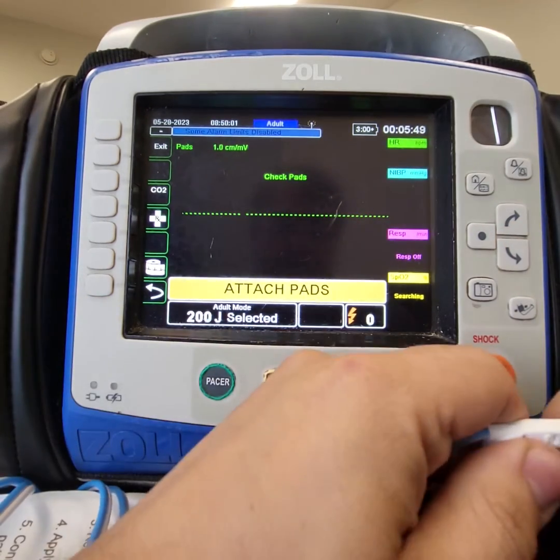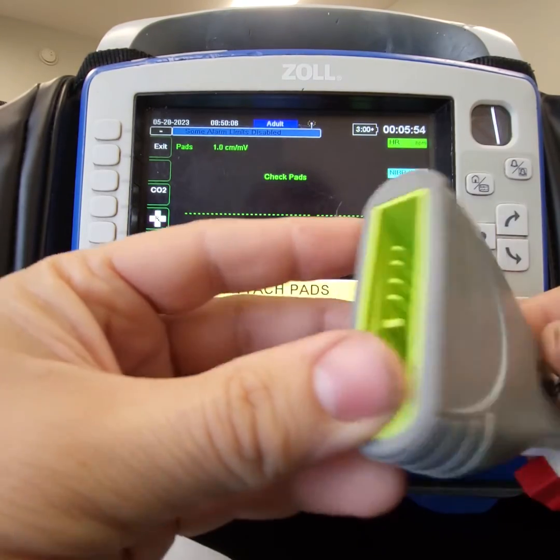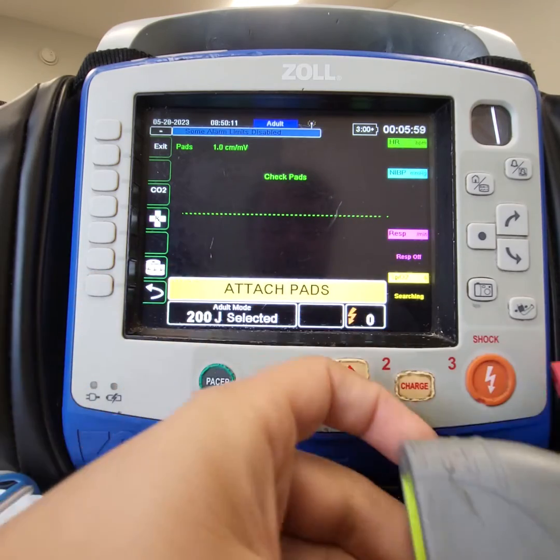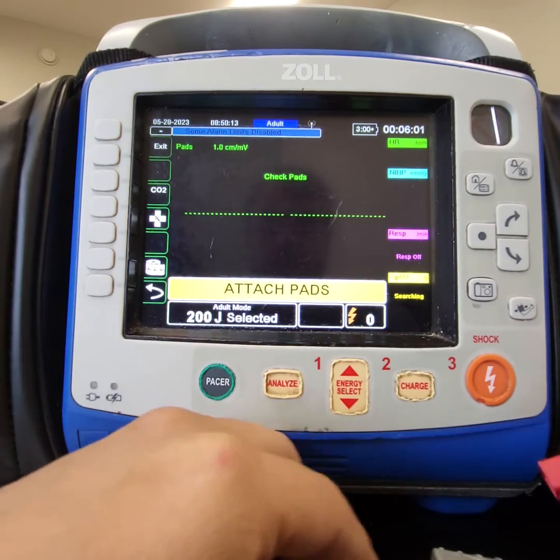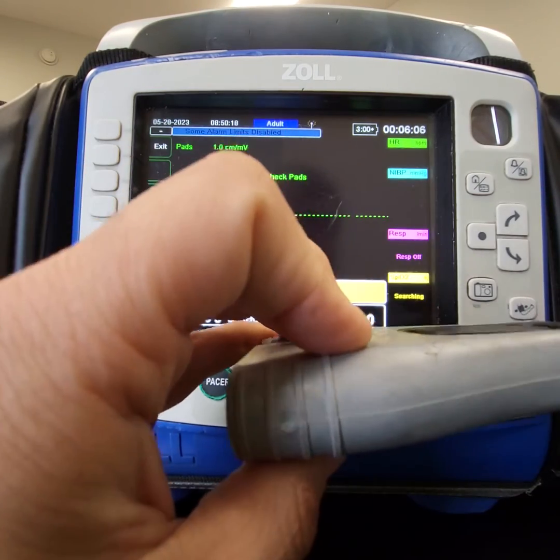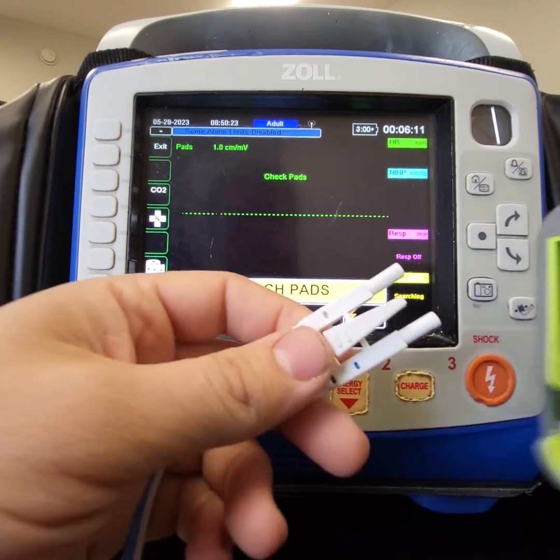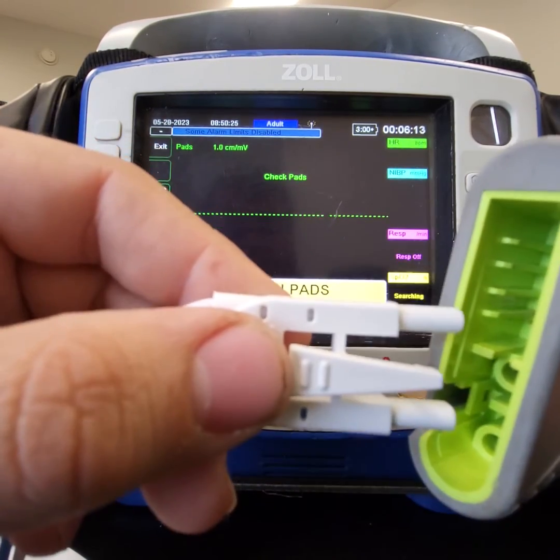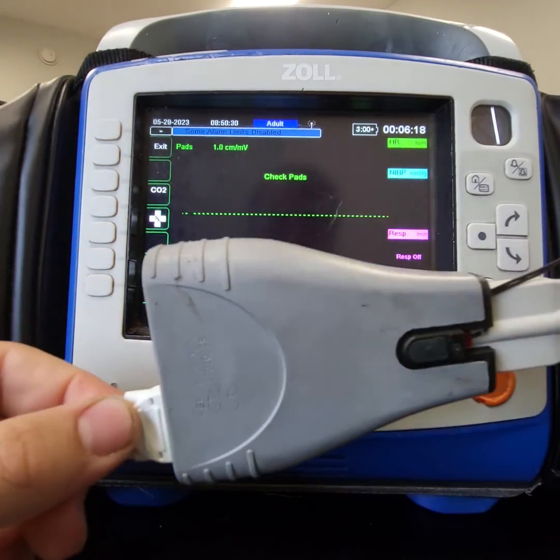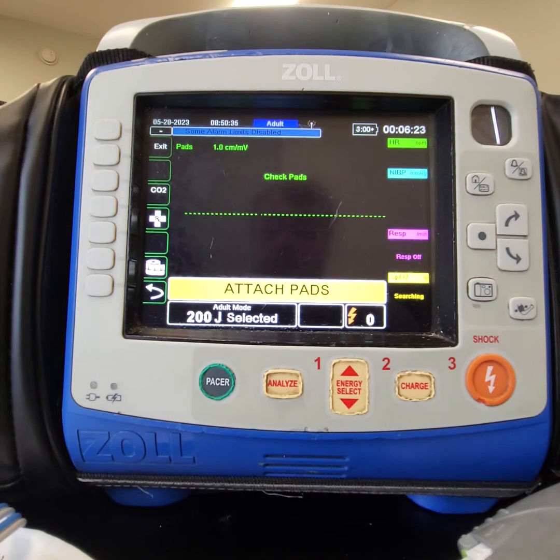Lastly, the conversion piece that converts the green plug on the Azul pads is not needed for these pads. You could still use it if for some reason you couldn't get it off. You can stick that together and inside you can see the connector is still in there. You can use these together, but it's just an extra step and wholly unnecessary for our pads.